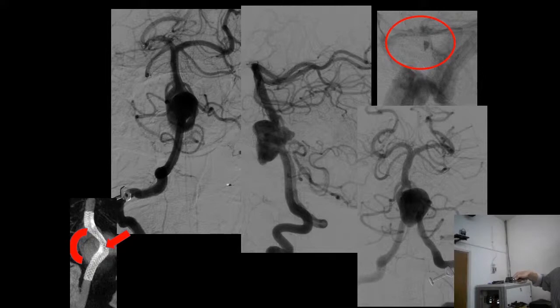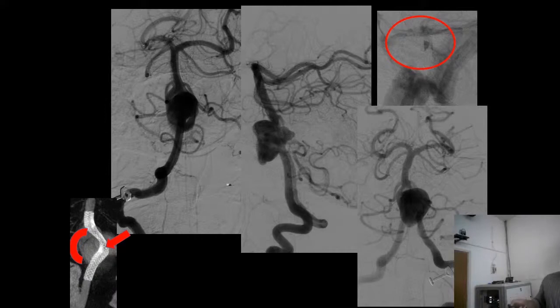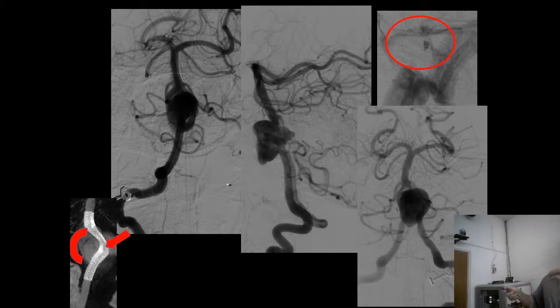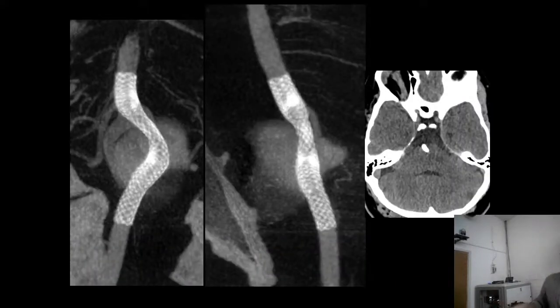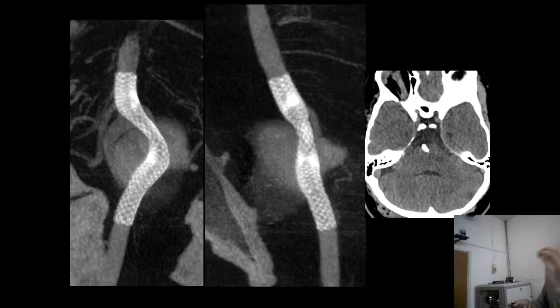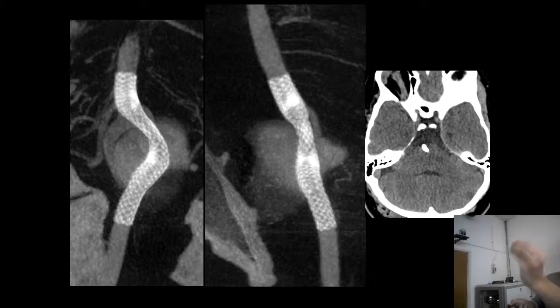We did not touch the aneurysm or the right limb of the fenestration. Post-deployment runs showed the aneurysm still filling, with all basilar artery branches and posterior circulation patent. On the lateral view, the most anterior part of the aneurysm was no longer filling, indicating slowed flow. On delayed lateral images, contrast stasis was seen in the lobule — indicating stagnation within the aneurysm. DynaCT images showed a well-placed stent, with some narrowing in a segment where the artery was small and the device did not expand completely. Since this is a dysplastic artery, no balloon was used.